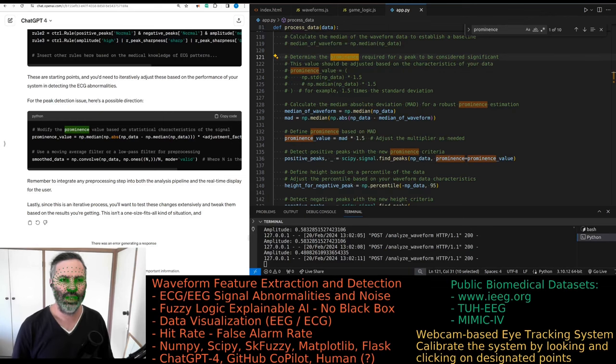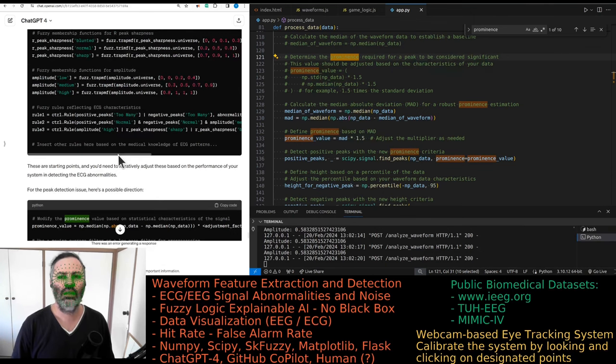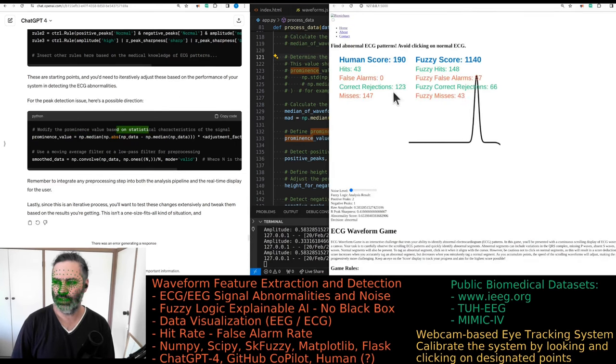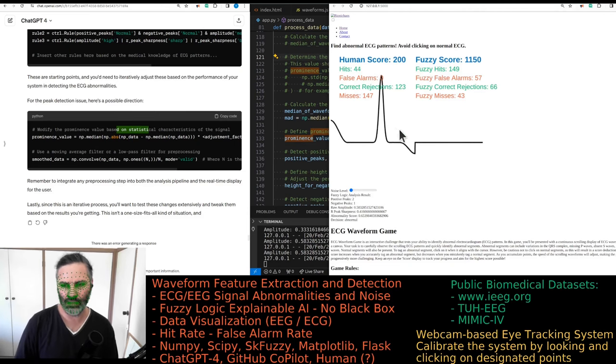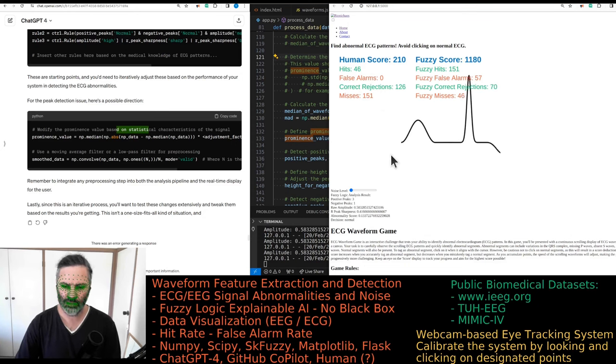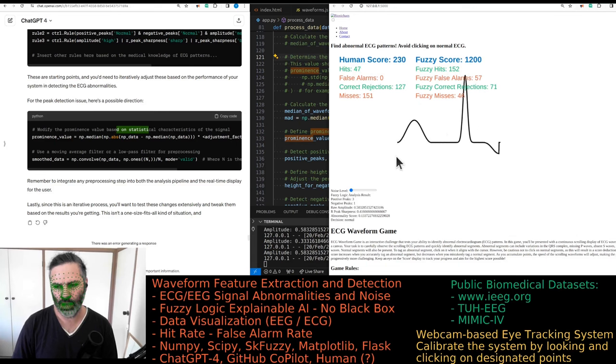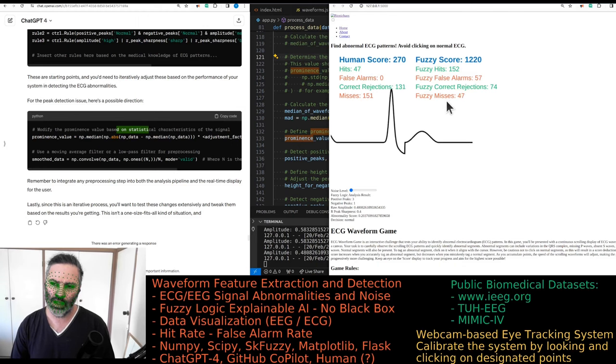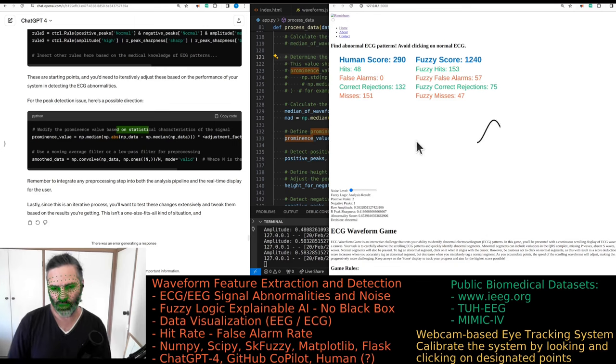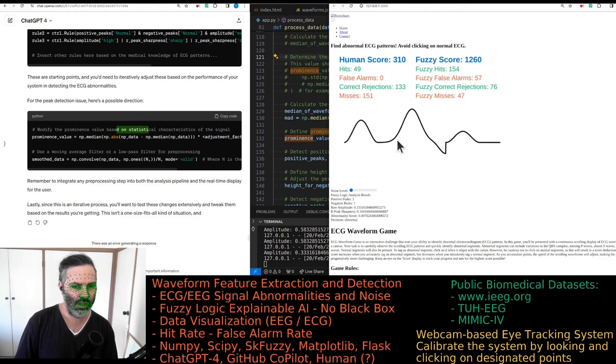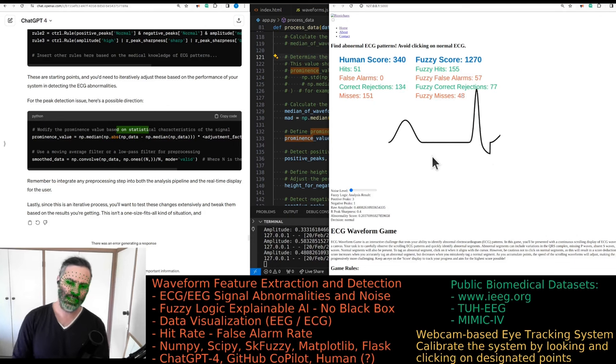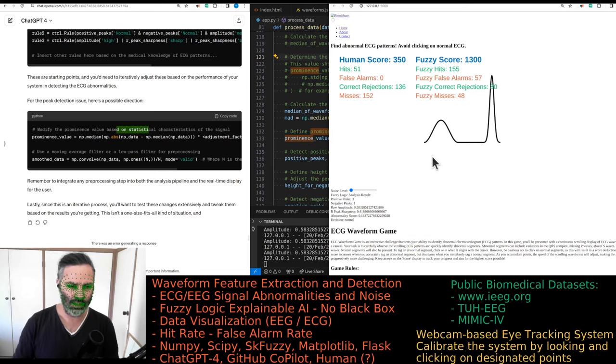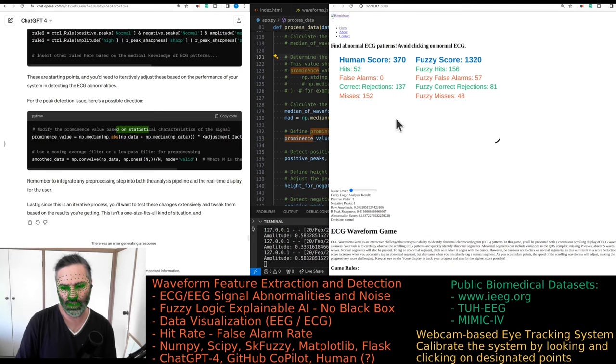Quick recap: we tried this one-shot prompt of GPT-4 to try and fix some things with this fuzzy logic algorithm that is playing this ECG scoring game that's currently hallucinating a bit. There's one of the waveforms that it never detects correctly, that's why the misses. One abnormal ECG, yes I know which one it is.